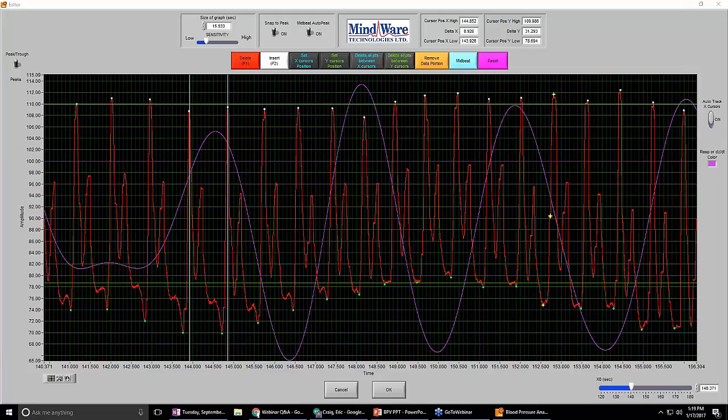Okay, we do have another question here about whether the program automatically tracks how much artifact you have corrected in your file. To answer the question, unfortunately, no, it does not track how much you have corrected. We've definitely considered that within the application. Within the field, it's very commonly cited, such as by Gary Bernston or John Cacioppo, that there's a 10% rule.